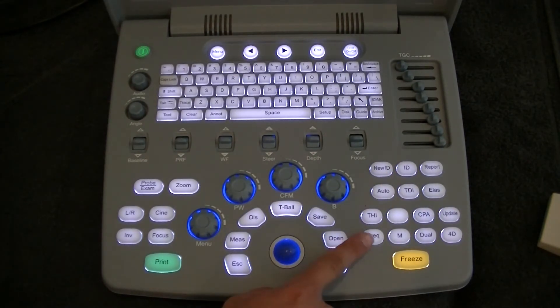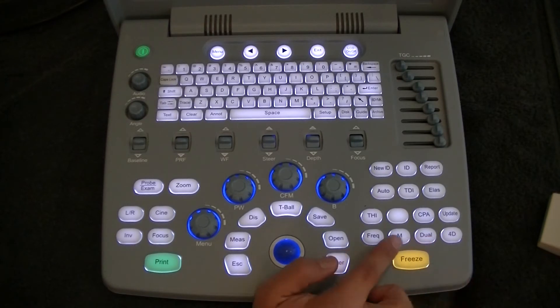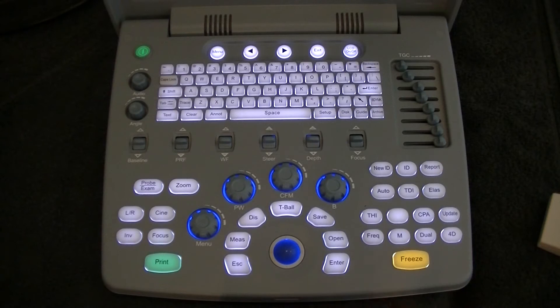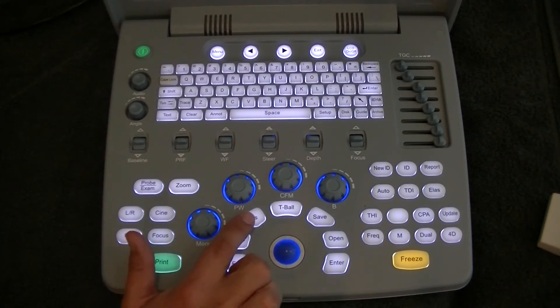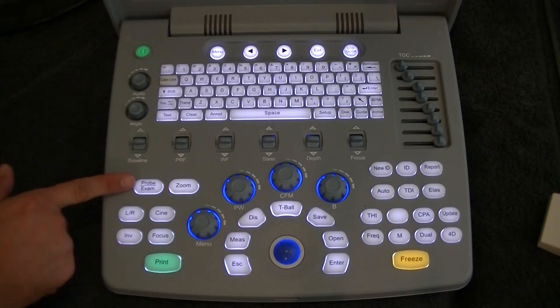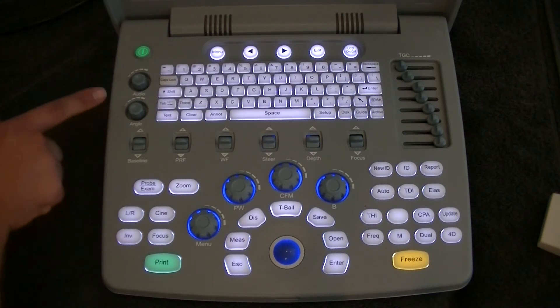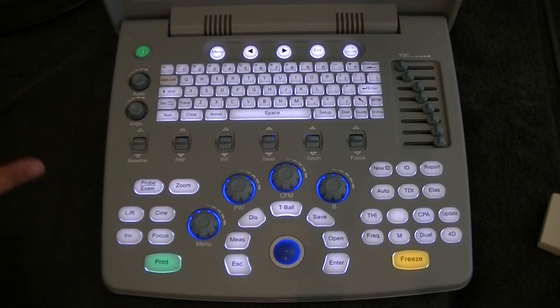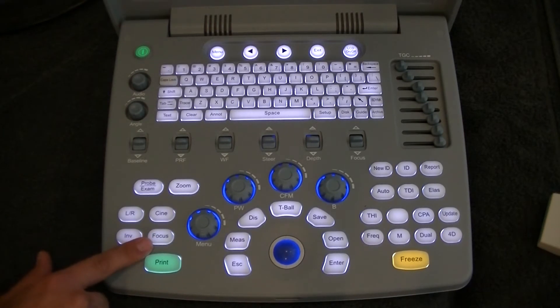We also have frequency, and the various imaging modes such as M mode, split screen, and four screens. Here we also have our trackball, measurement, and distance. This lets us select our probe and also set the probe presets. Most of the other buttons are used for color Doppler or pulse wave where that's enabled on the machine. We also have the focus button down the bottom.